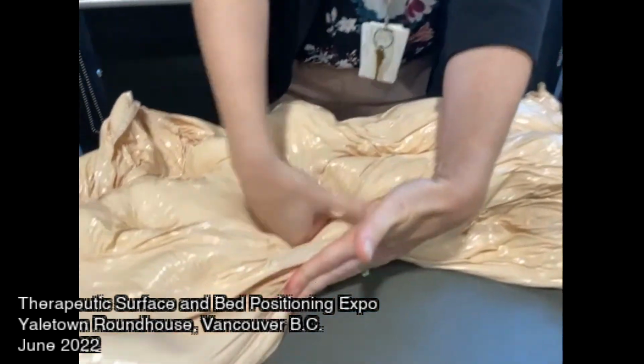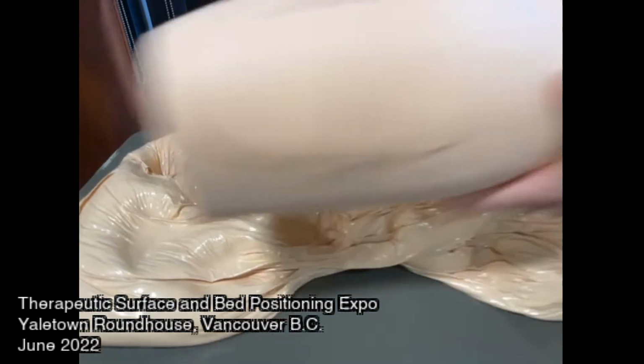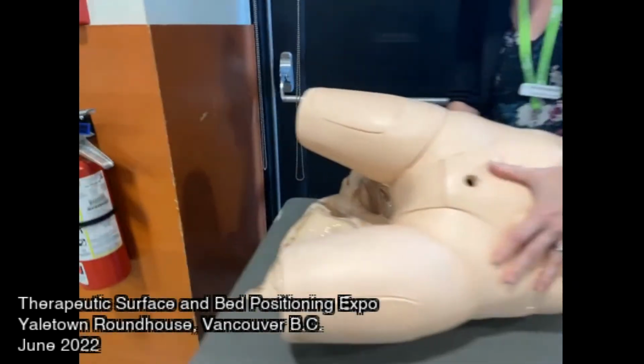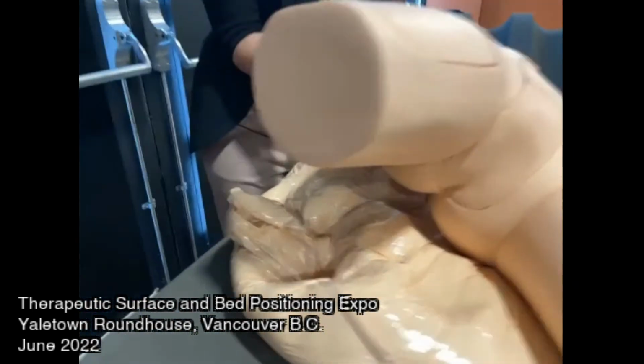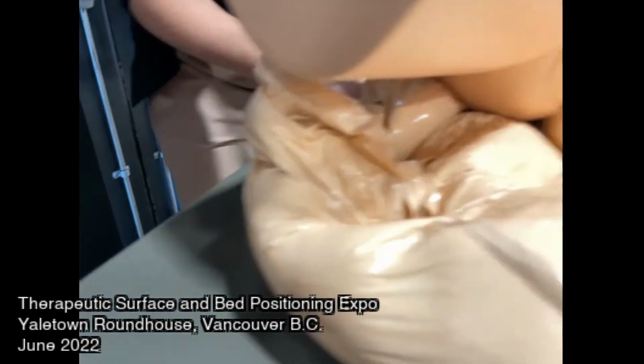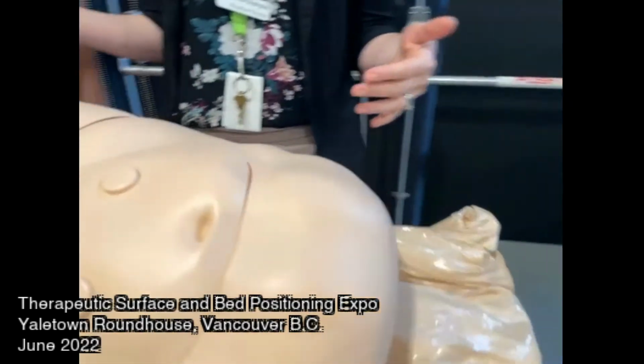We're going to hollow out an area, and then position our resident. As they're here, continue to push this in to provide support, and it will hold its shape.